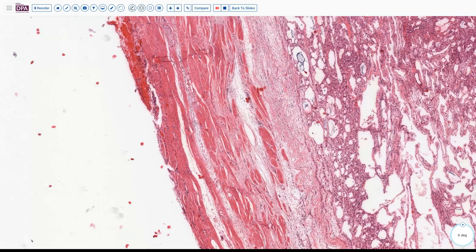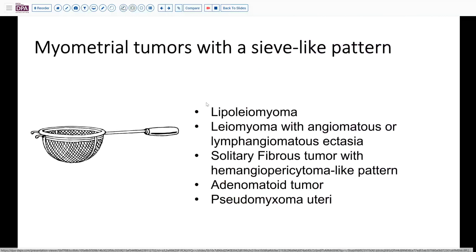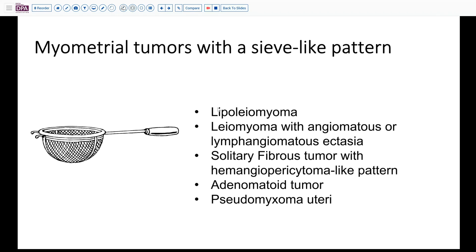Let's think for a minute about what could be causing this. I will note that this is a distinct morphology from that of the patient's serous carcinoma, so it doesn't look to be related to the patient's serous carcinoma directly in the sense of being the same lesion. The pattern that I think we saw is what is commonly referred to as a sieve-like pattern.